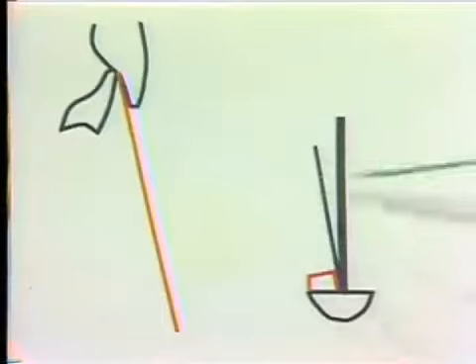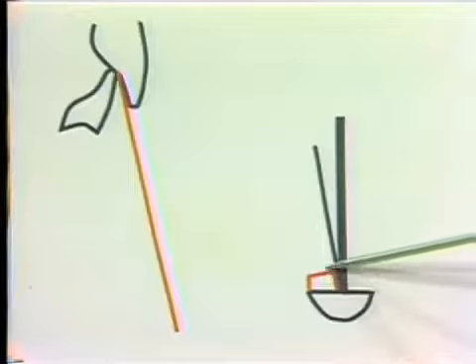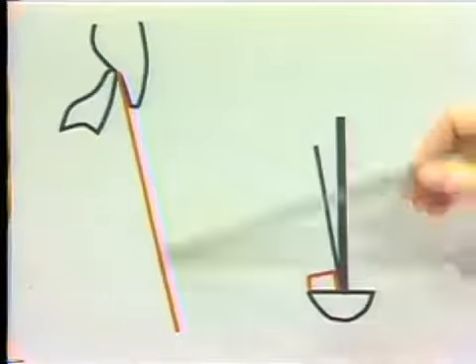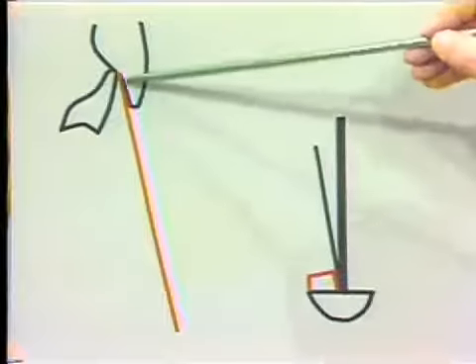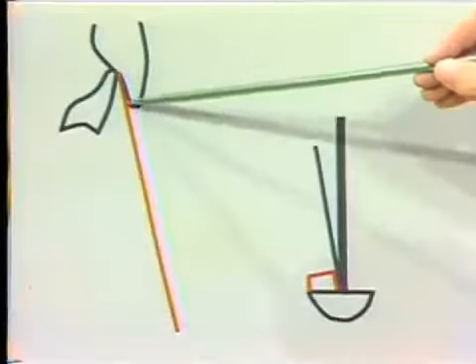So it is going to be the purpose of this procedure to construct a little acrylic incisal guide to simulate this angle. This line here will be parallel to the lingual surface of the maxillary teeth.